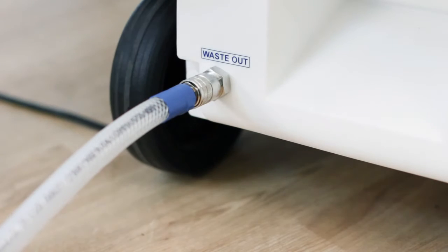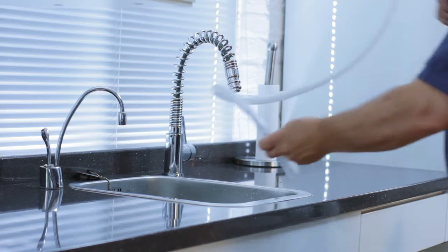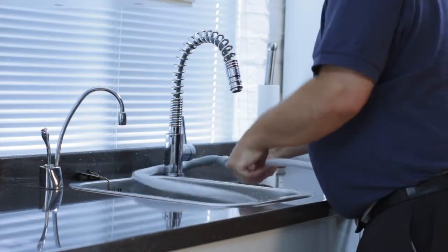Connect the waste out hose, which has no filter, to the bottom left-hand socket of the Watergenie and place the other end in a convenient drain.